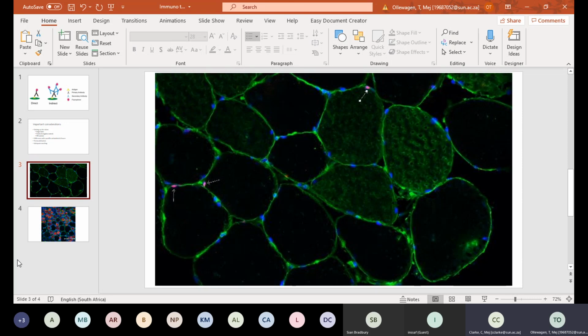And as the previous talk mentioned, sometimes you are restricted with the host of antibodies that you're using, and ideally in any stain you'd want to use different hosts because you don't want your secondary to bind unnecessarily. But there is the option to use the same host where you would block in between.